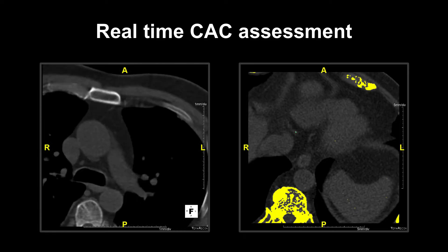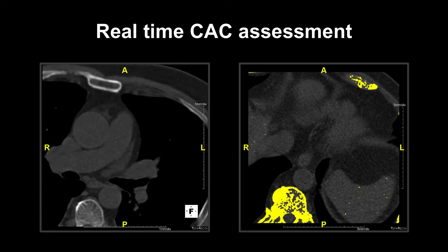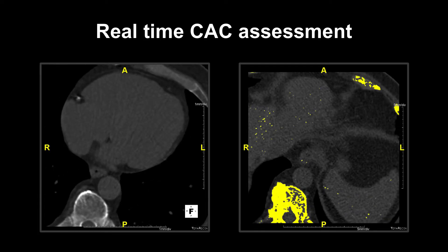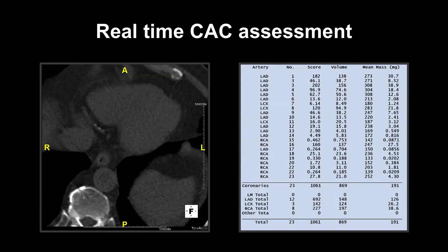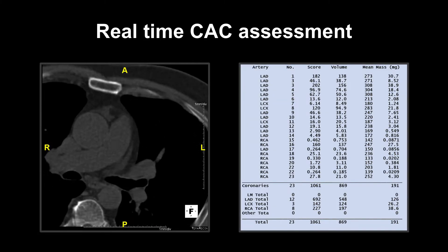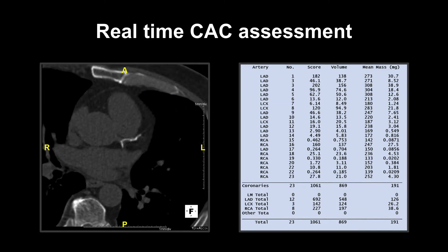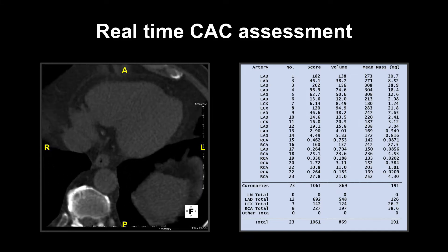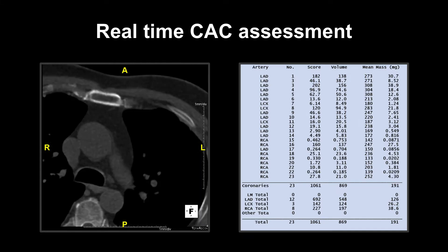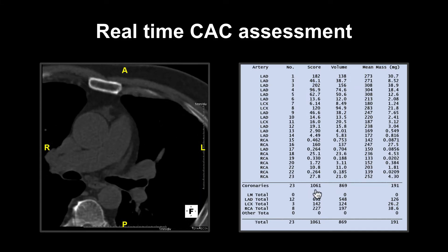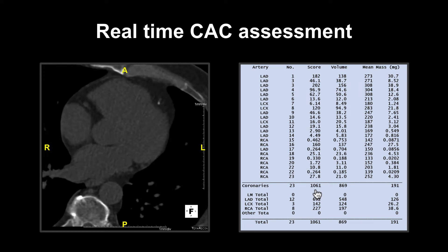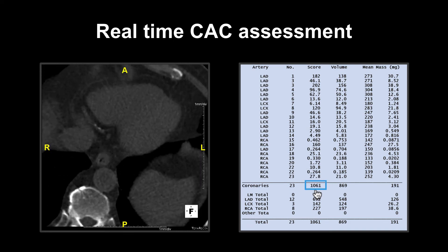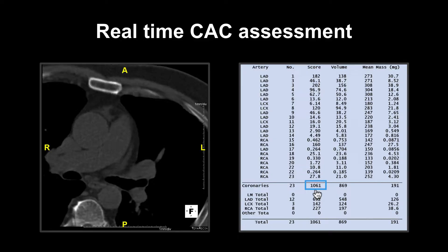Once all of the coronary calcium has been marked and colour-coded appropriately, we are able to receive an output of the total coronary artery calcium. In this particular case, we can see that the total coronary artery calcium score for all of the coronary arteries was 1,061 Agatston units.